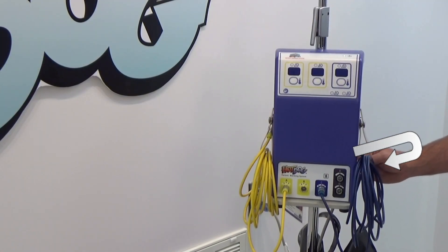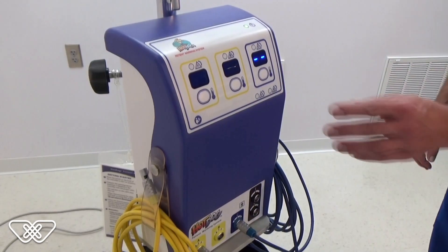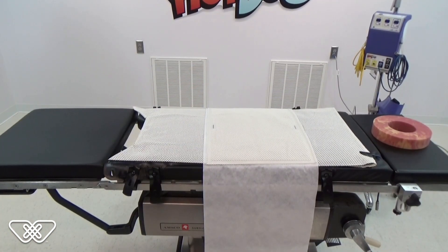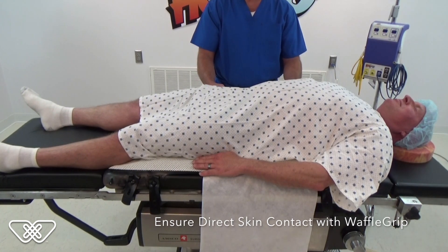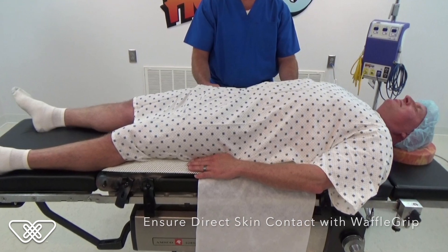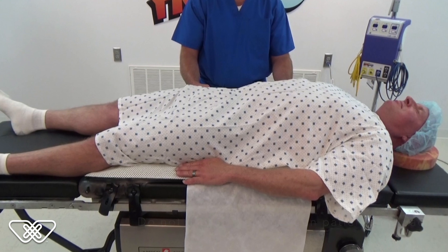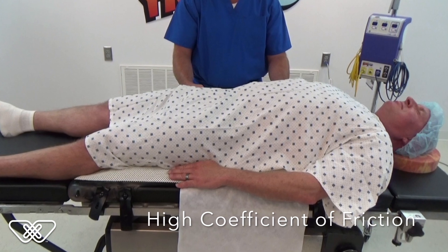Turn on the main power to the controller from the switch near the power cable. It will cycle through a diagnostic check and beep when ready. Toggle the temperature on the C-port to 39 degrees Celsius, the maximum temperature. The Waffle Grip pad and draw sheet are now ready for the patient. For the purposes of this video the patient is wearing a gown. During real surgery the patient's gown would be removed so that the skin would come in direct contact with the Waffle Grip pad. Do not place a barrier between the patient and the Waffle Grip pad. The friction and mechanical grip pad are designed to be in direct contact with the patient to ensure system effectiveness and to maintain the high coefficient of friction.